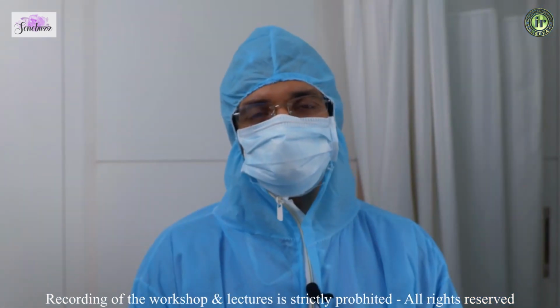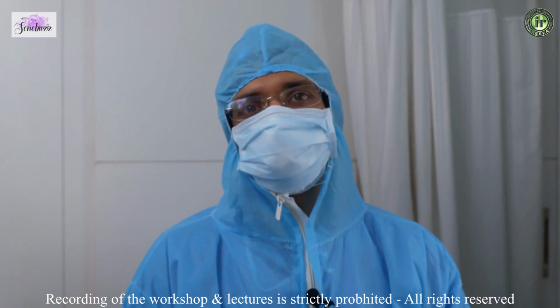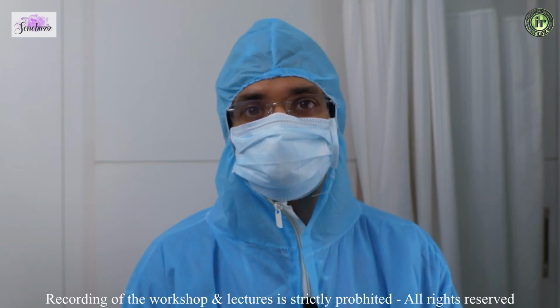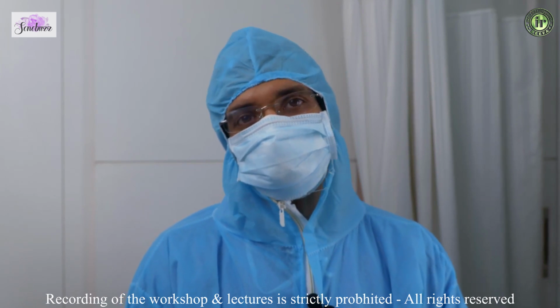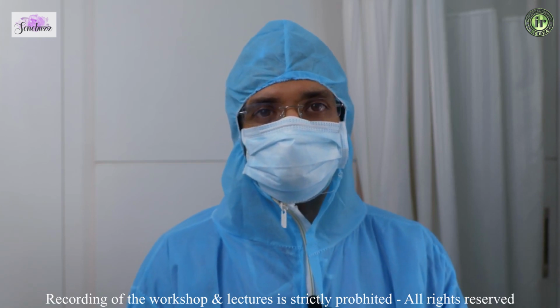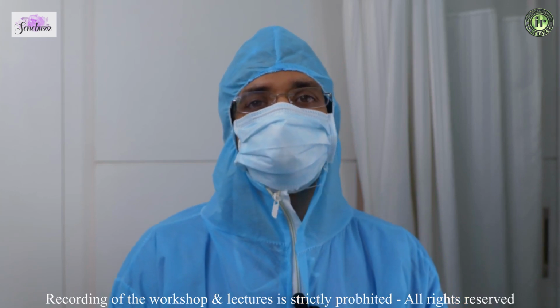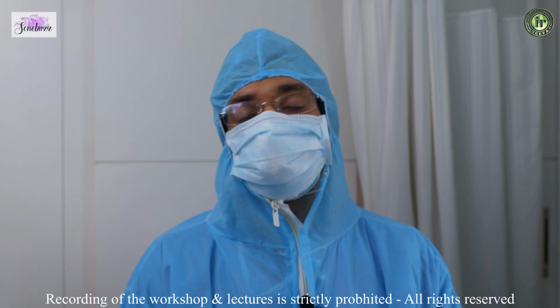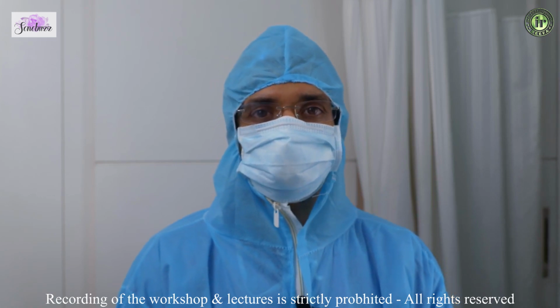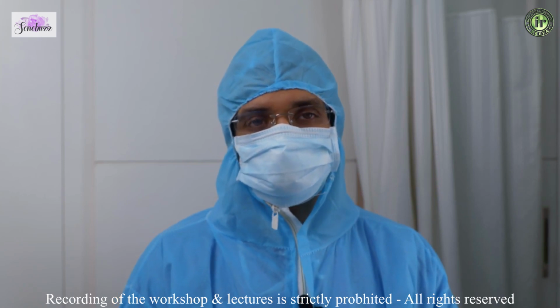because all that is going to hamper your readings. The other thing you need to keep in mind is normally we do these cases early morning in a fasting status. So 6 hours of fasting is ideally what you should do these studies with. But at times it happens that the patient walks in the afternoon, and you have to maybe do the scan at that time. So we have a look at everything, we take all the values. If we think they're getting elevated, this could be a false elevation because of the non-fasting status, and it may be a very good idea to see this patient again the following day. So this is one of the practices that we follow.